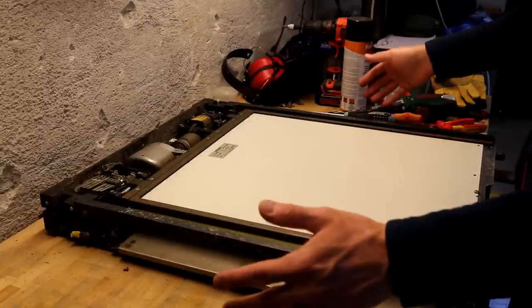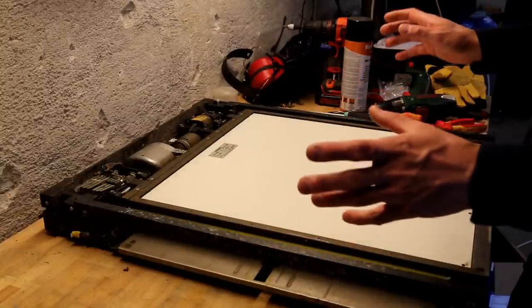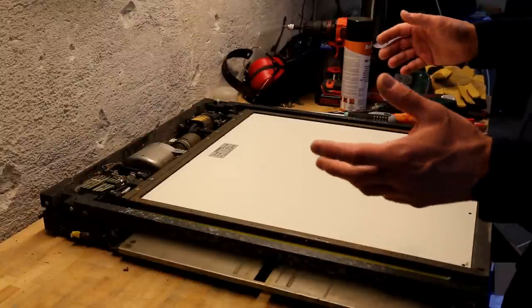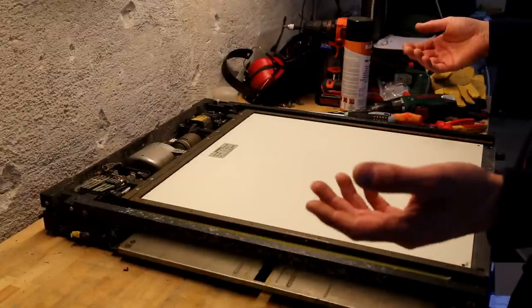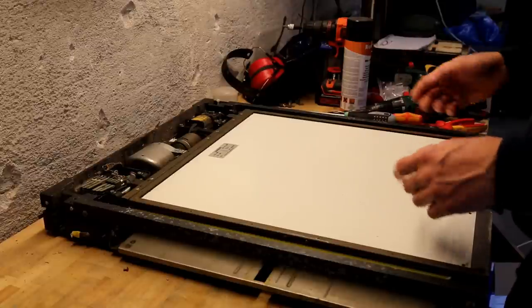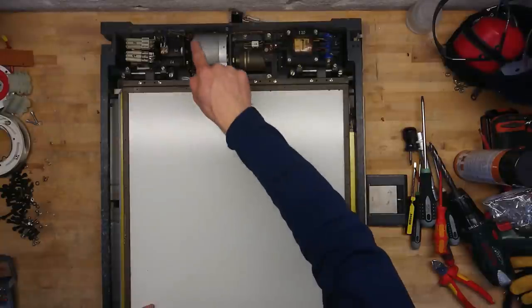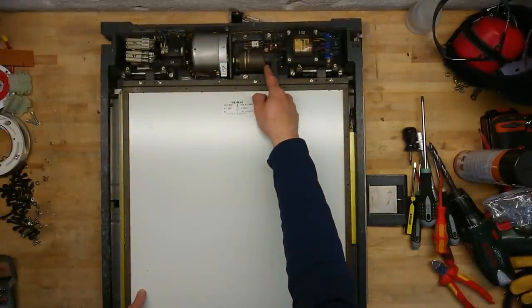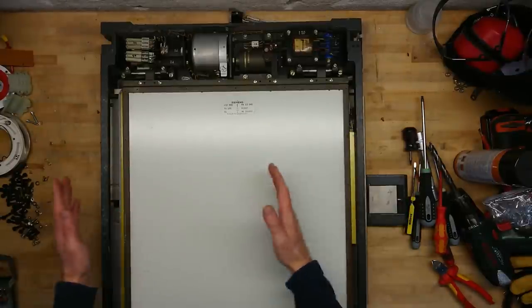Now this huge item is the image plate. And it's a little different from what I expected. I expected just to see a phosphor plate, maybe some kind of automatic X-ray detection, and then you can just put in your cassettes with the film in. But this actually has a motor with a curved surface on it here, so it can move this plate back and forth in this direction.